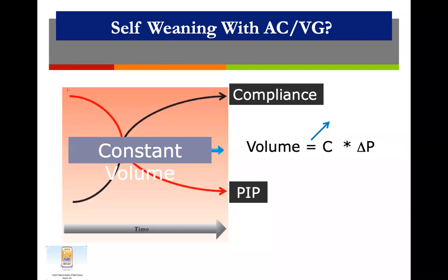So what happens is, it's like self-weaning. You can see that as the compliance is improving, the PIP is reducing on its own. Very beautiful it looks. So compliance is improving and the pressure is reducing.